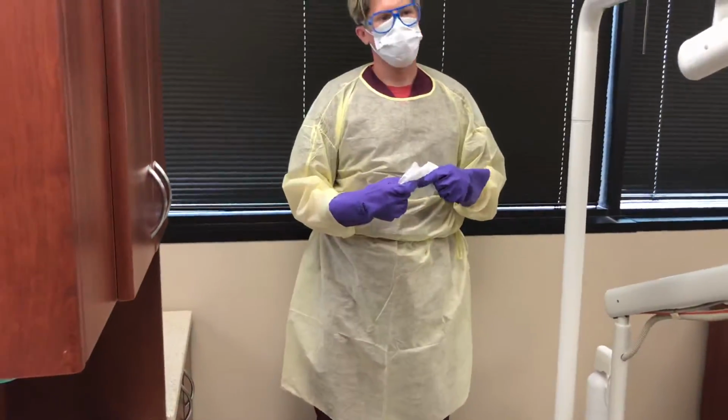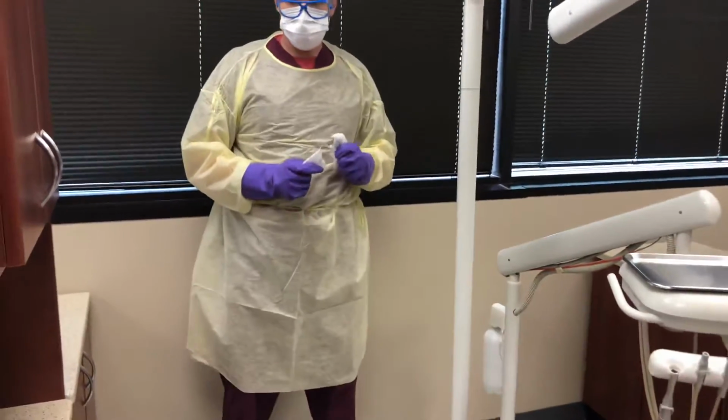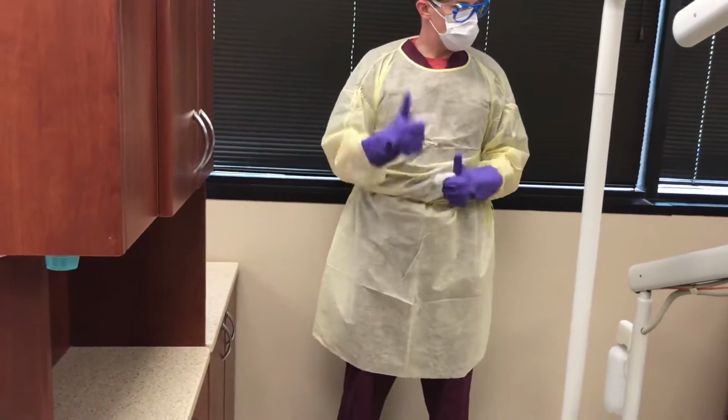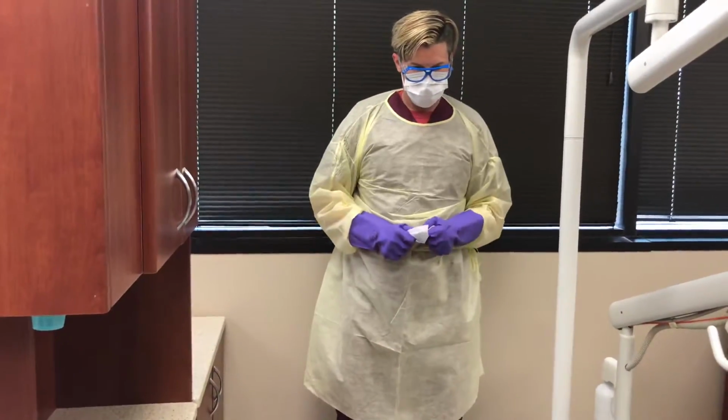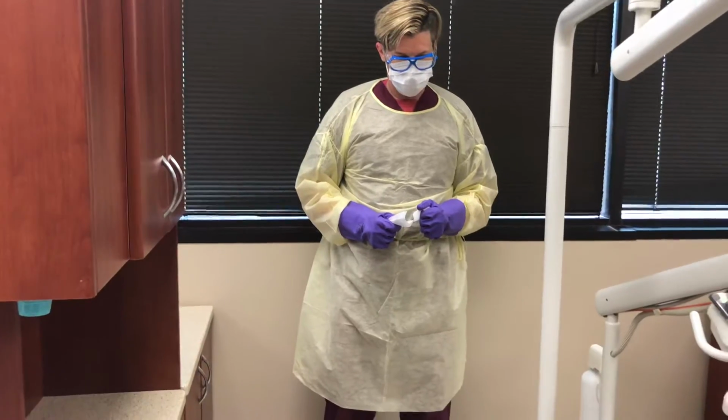Plastic barrier on keyboard, which has already been done. Sink rim, soap pump, and faucet handle, which has also been done. Inside collar of trash bin, which has already been done. Clinician and assistant chair levers.